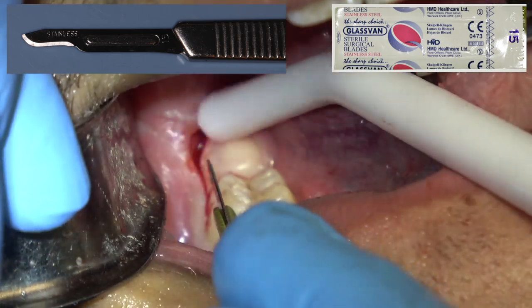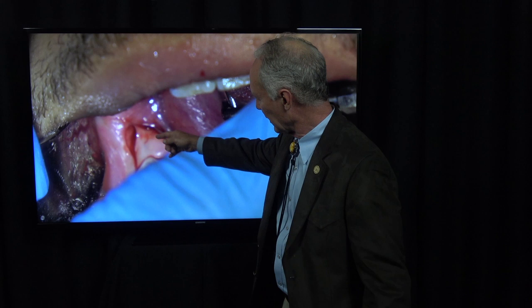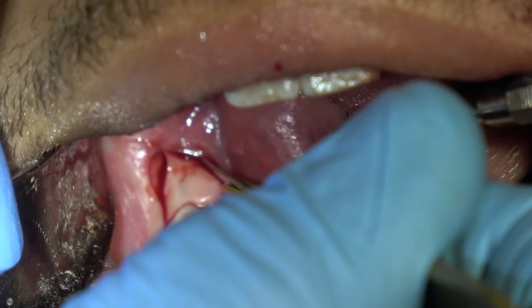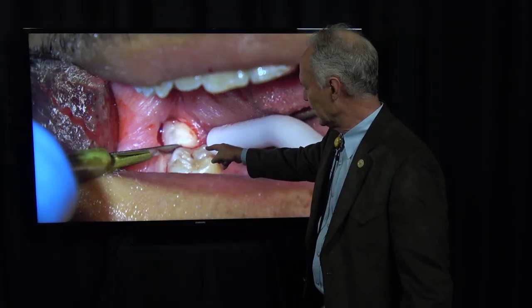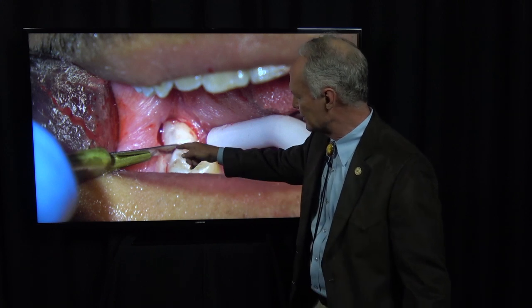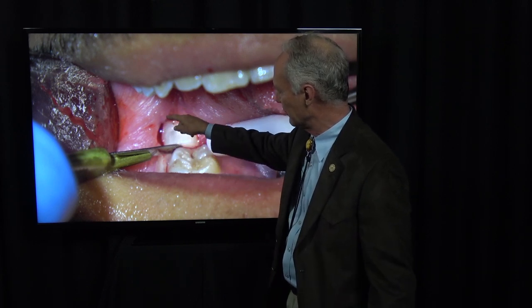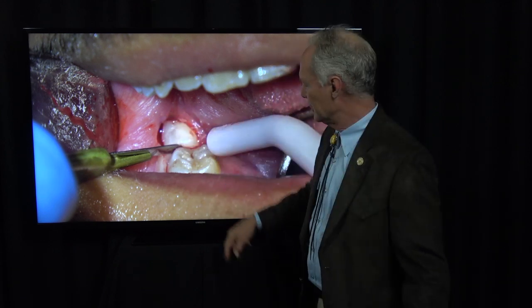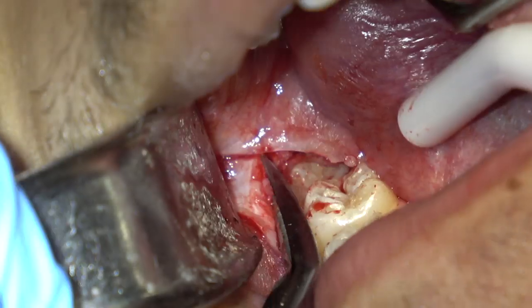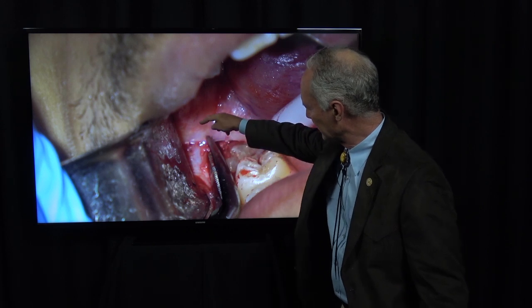I'm making an incision on the facial side of the impacted mandibular wisdom tooth and on the lingual side of the second molar tooth. Don't extend that incision very far lingually because you don't want to damage the lingual nerve. This incision goes to the distal lingual aspect of the second molar, and then you make an incision on the distal of the second molar. The incisions meet on the distal aspect of the impacted third molar from the lingual and the facial.